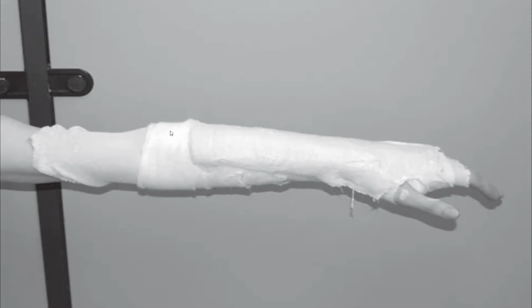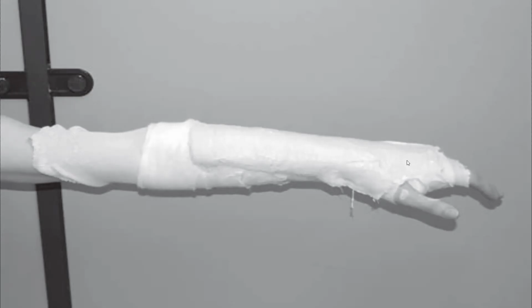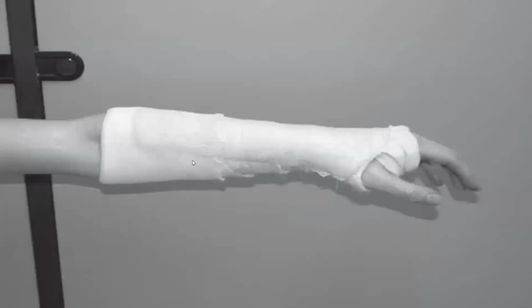Why? Better for flexion. Then do smoothing or molding. You will do smoothing or molding. So you will put on the dorsum of the arm. Once you apply the plaster bandage, you will fold the stockinette.